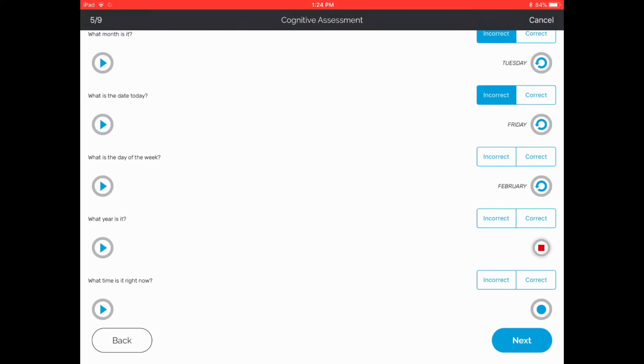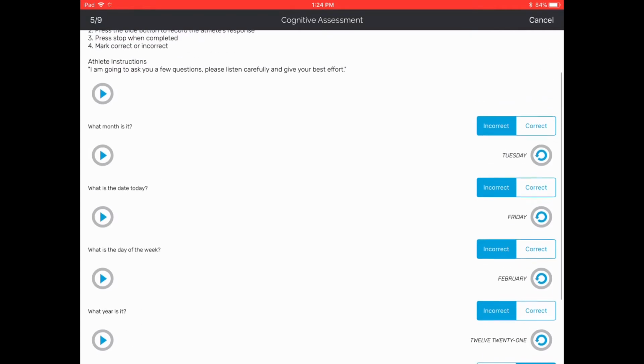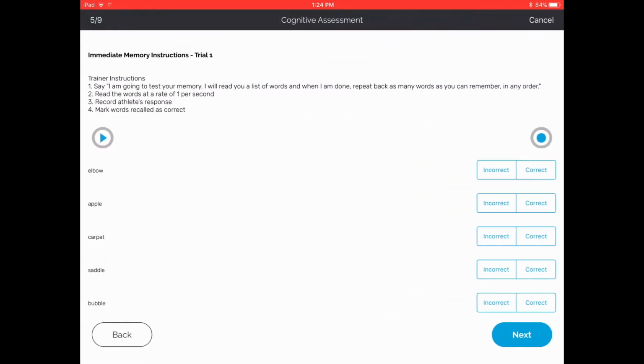What year is it? What time is it right now? So you can go in and correct any mistakes that you think you saw, correct, incorrect. You have complete control. In this next section, the computer will do all of that for you.